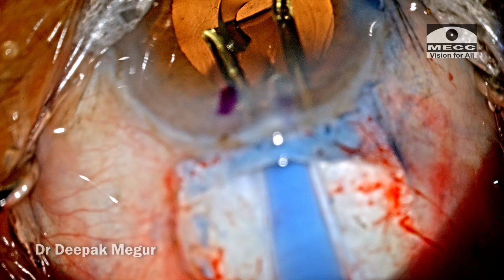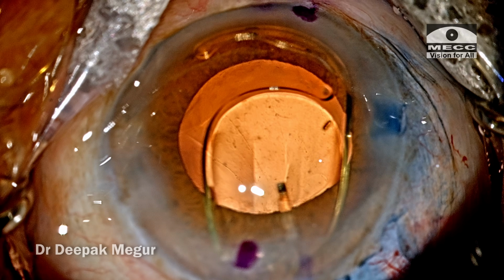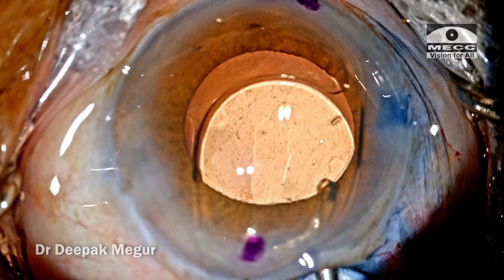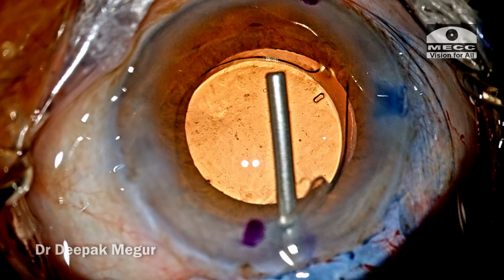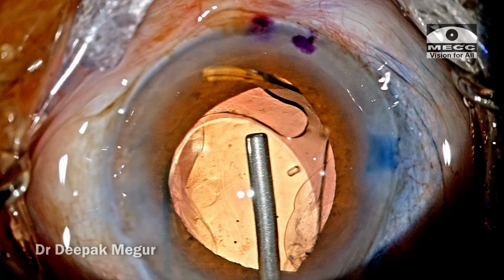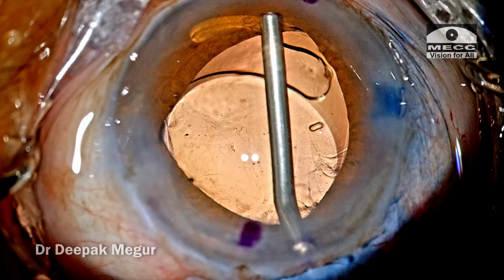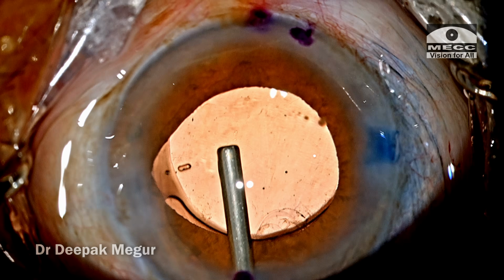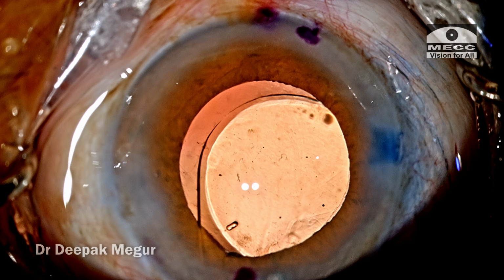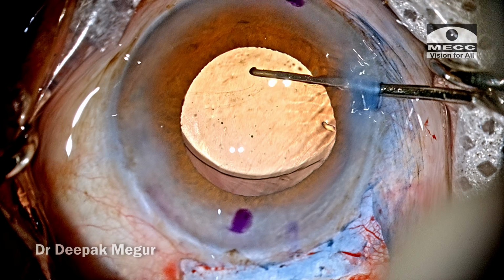In these foldable lenses, some of them, sometimes I feel it is better to implant them with the injector itself, because they are not so rigid, and manipulating the haptics inside the bag can be tricky, unlike a rigid lens. So there's a reason in this case I'm consciously using an injector to do the job for me. The chamber is again inflated with OVD, and the trailing haptic is dialed into the bag.